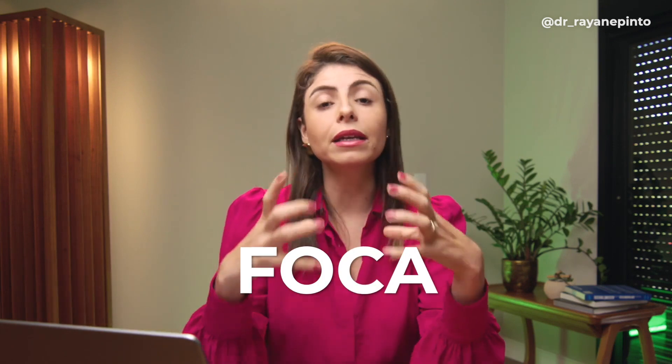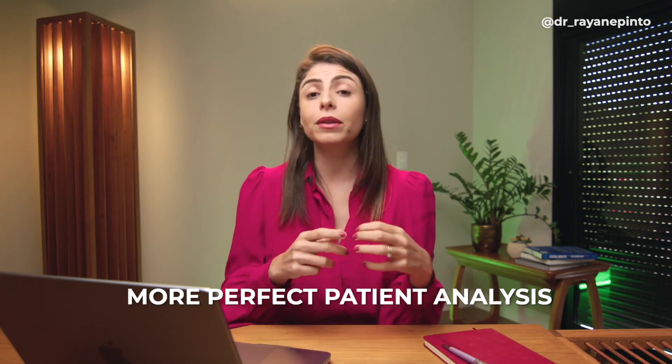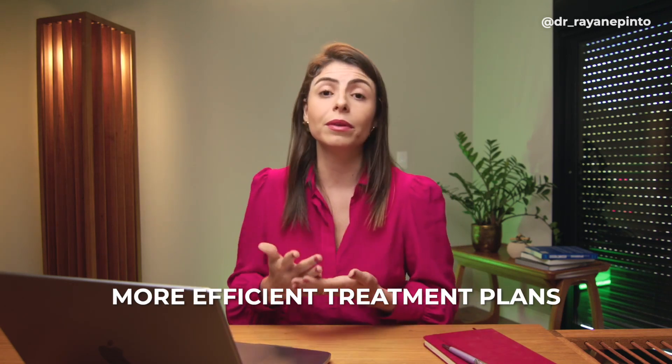If you've attended any of my classes, you know that I have a diagnostic criterion called FOCA — the facial, occlusal, cephalometric analysis, and anamnesis — and the facial analysis comes first. When I saw that it would be possible to place the patient's face in 3D to do volumetric analysis, I was completely in love. Diagnoses can be much more precise, allowing a more complete analysis and certainly more efficient treatment plans.